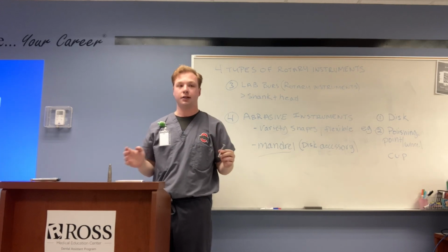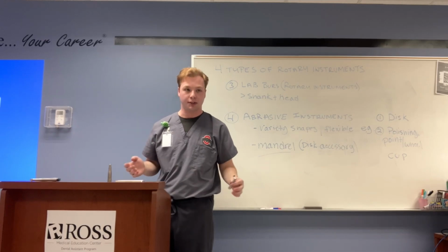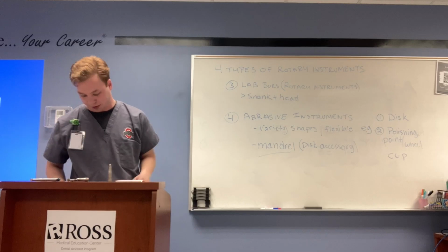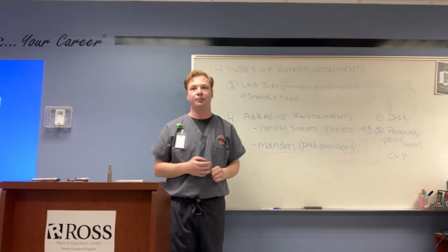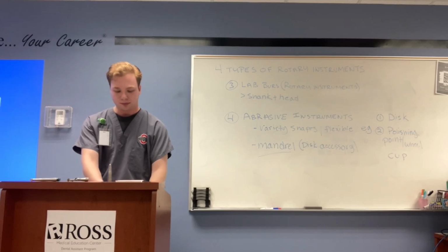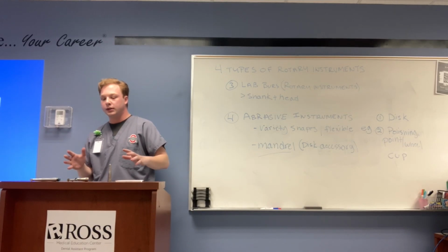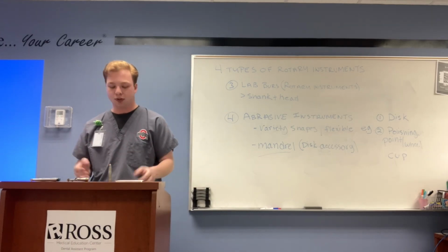And in your dental office, we never had enough and we always lost them. So be careful and watch out for your mandrels. Okay? How does everyone feel on that? Does that make sense? So we talked about high-speed handpieces, slow speeds, and we talked about different diamond burrs and burr shapes.